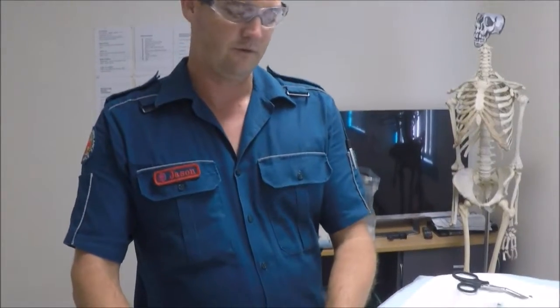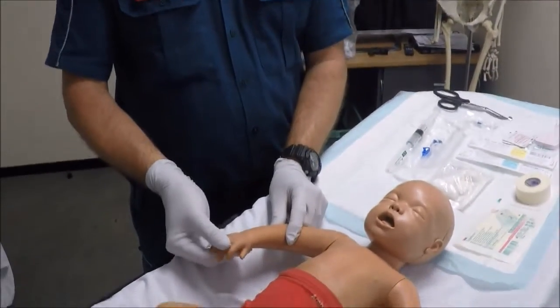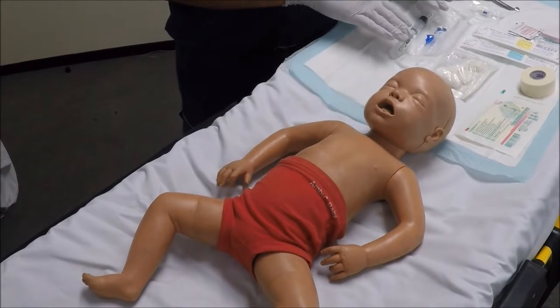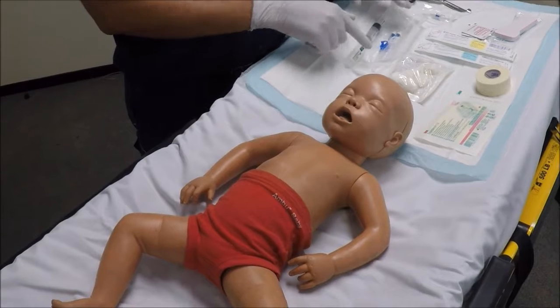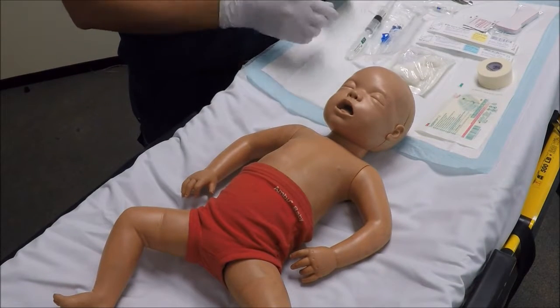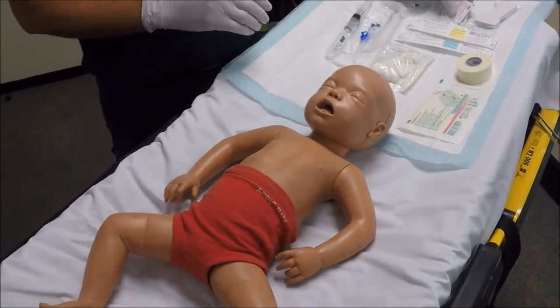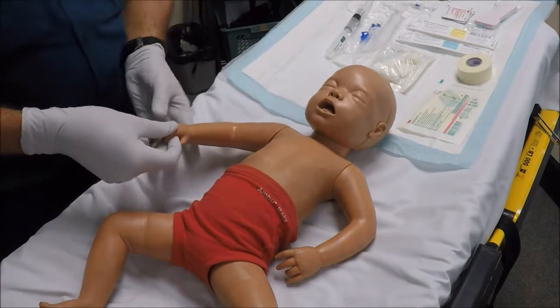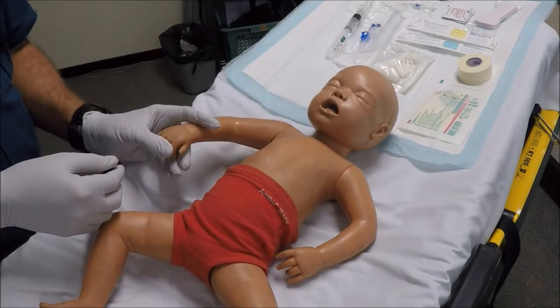For this part of the presentation I'll give a practical demonstration of cannulating the dorsum of this paediatric patient's hand. I've got my equipment set up: I've pre-filled my two-way extension line, I've got my 10mL syringe, bung, and some aseptic swabs.